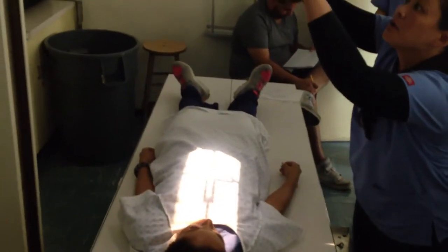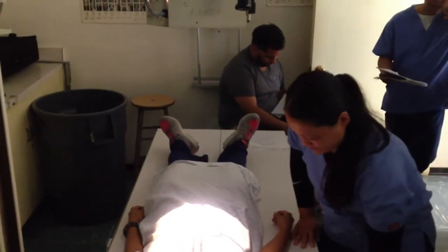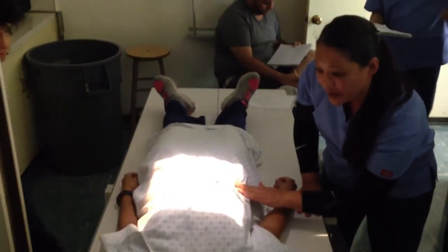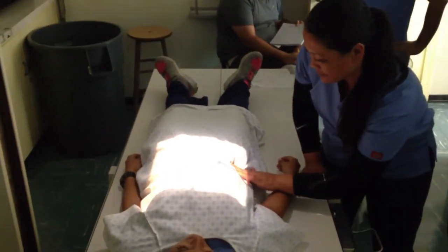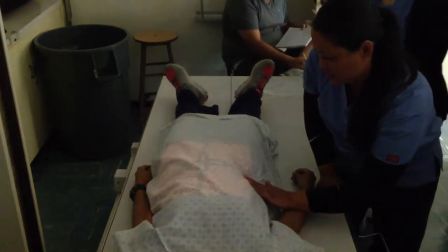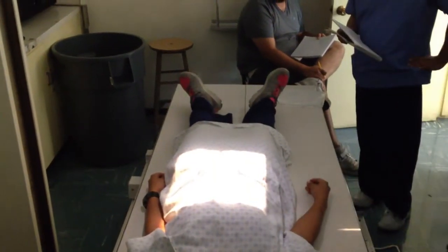Overhead for GI. Now feel for your crest. So this is going to be our first film — it's the AP. We just want stomach. Stomach sits high on a lot of us.